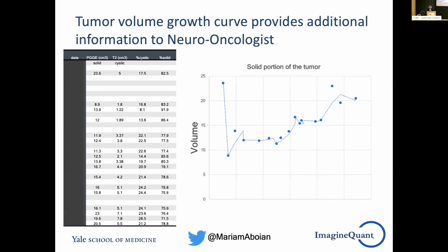So I actually started doing this at Yale when I joined there after fellowship. I pull out my Excel and I start doing the volumetric measurements for Dr. Marks. And it takes me a couple hours to do, but I feel strongly about it. And this is that particular patient, and these are the kind of treatment response curves I provide for him. And that does help him in deciding whether to treat the patient or not, as you can imagine.